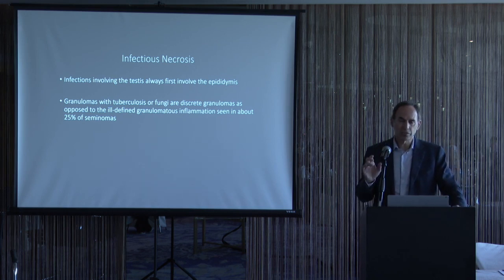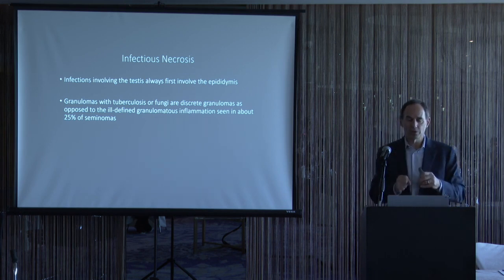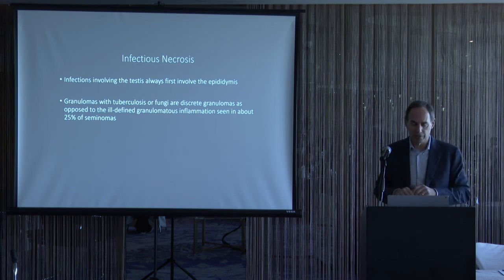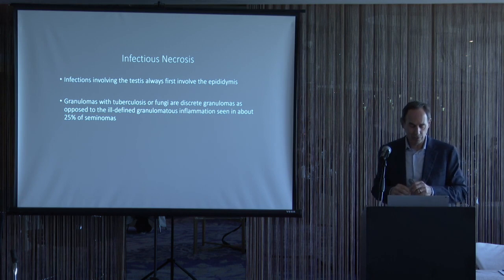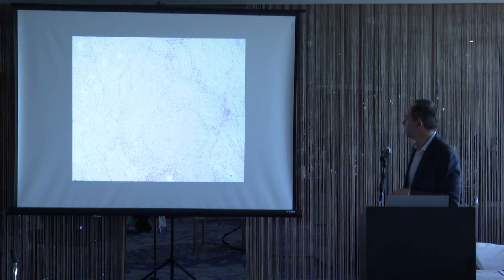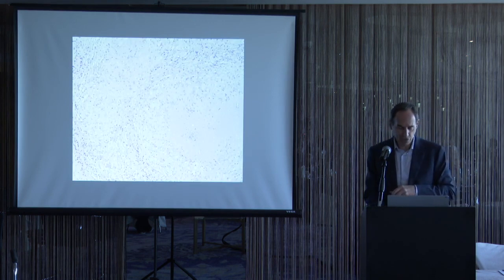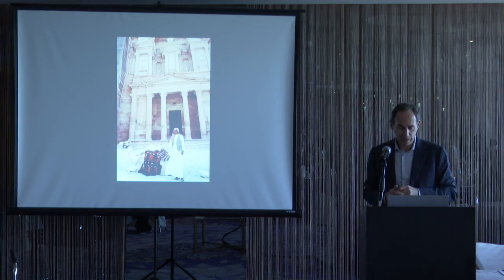Also, there's a distinction when we look at the granulomas associated with seminomas. They're not discrete little cannonballs of granulomas. They're more ill-defined granulomatous inflammation, not discrete round granulomas. When you get infectious granulomas, they tend to be more well-defined. So, for example, this is a case of tuberculosis involving the testes. You can see these more discrete, rounded granulomas with caseous necrosis. A little higher magnification, and this is from Petra in Jordan.